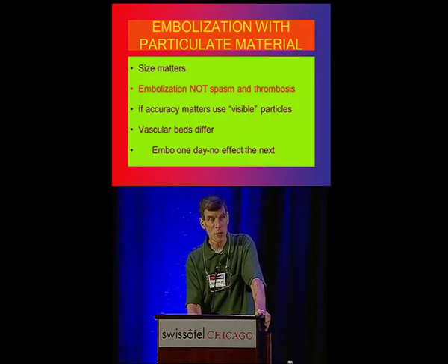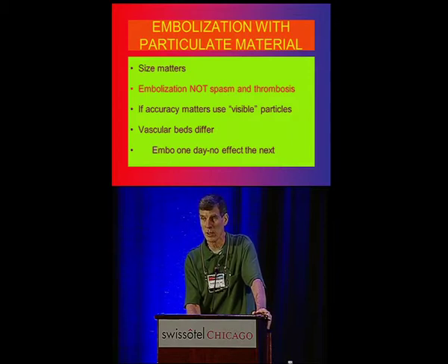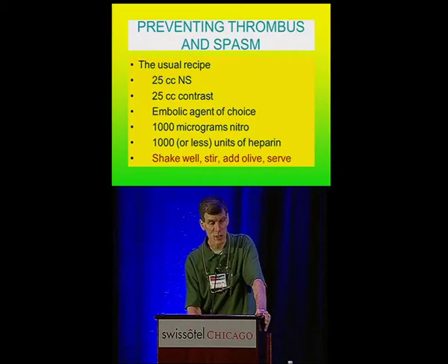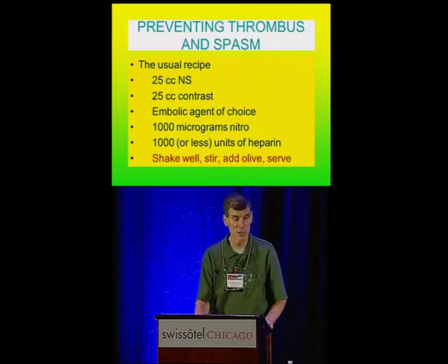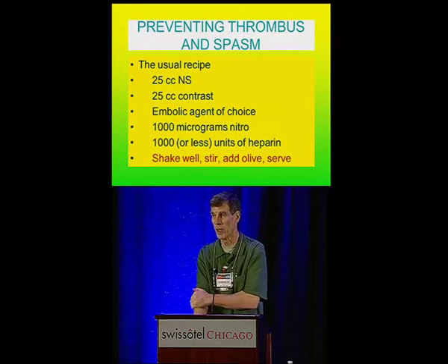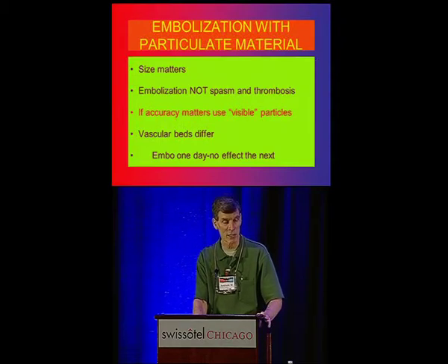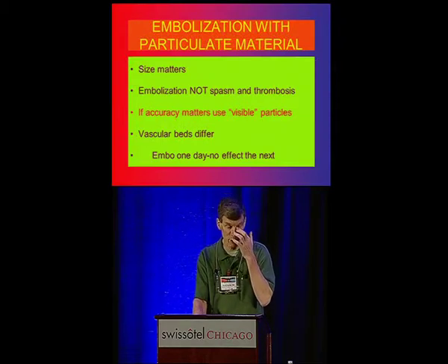I also do all my particulate embolization without causing spasm and thrombosis, which can kill you because you embolize and you go back and you find that you didn't do anything a week or two later. And that's because you had a lot of spasm that relieved and thrombosis that spontaneously recanalized. And in order to avoid that, I always use a mixture of an embolic agent with nitroglycerin and heparin for every embo that I do. I even do that for UAEs and other embos in other areas that I do, so I don't get spasm and thrombosis complicating my embo picture.